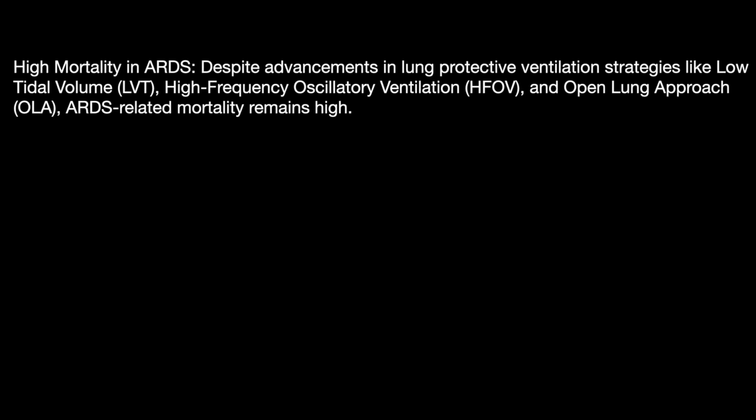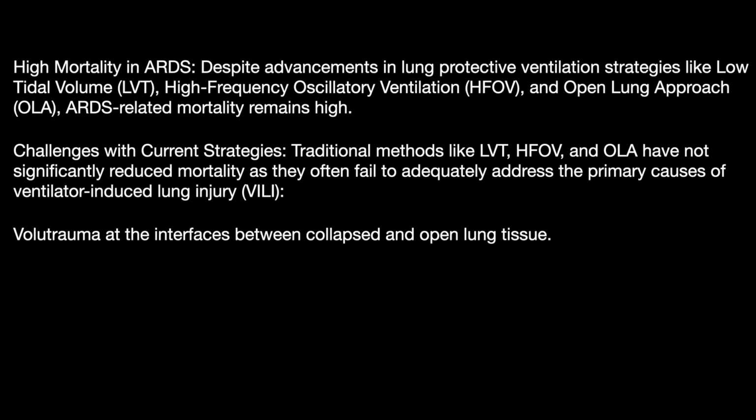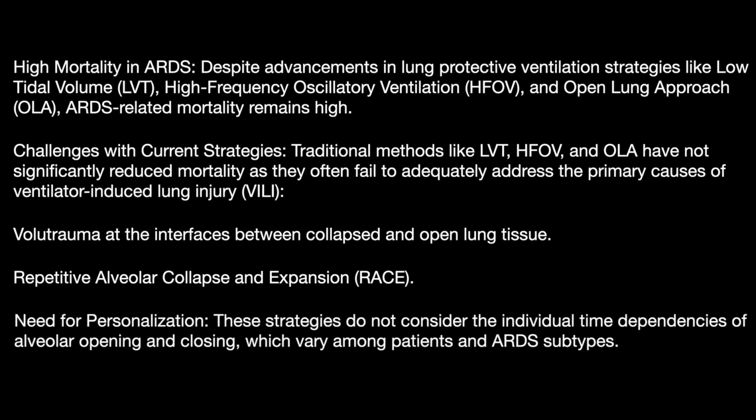So what is our take-home message? The take-home message is we still have very high mortality despite different ventilation plans in ARDS. The traditional methods, that is low tidal volume, high-flow oxygen, high-frequency oscillation, and the open lung approach, have not reduced the VILI. The interface between the collapsed and the open lung tissue is still occurring, and the need for personalization is the need of the hour.